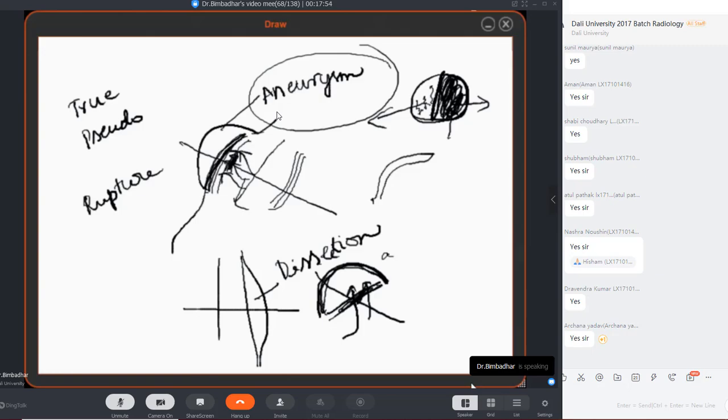But if I see a gross expansion of the diameter of the artery, that is called an aneurysm as well. So we will see it on radiograph and CT. See, the mechanism of how it tears is just reflected in the radiograph as well.